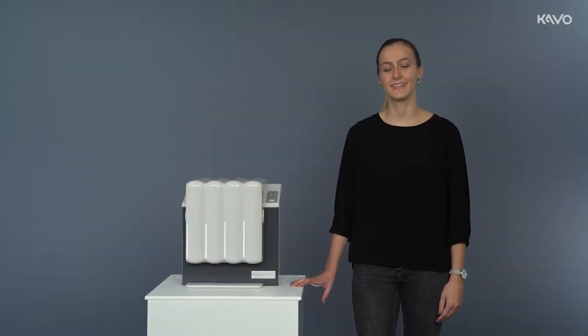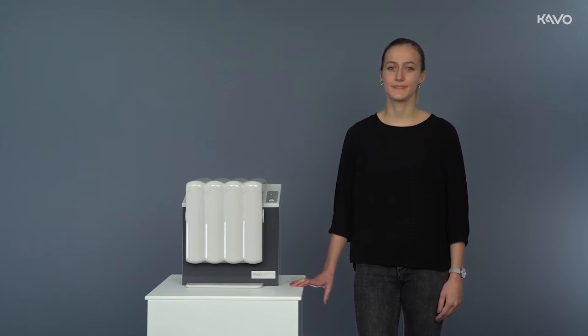The following video covers how to operate the QuattroCare Plus automatic maintenance device. Our product manager Laura Moore will guide you through the demonstration.